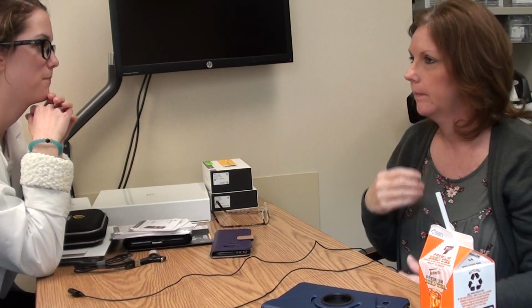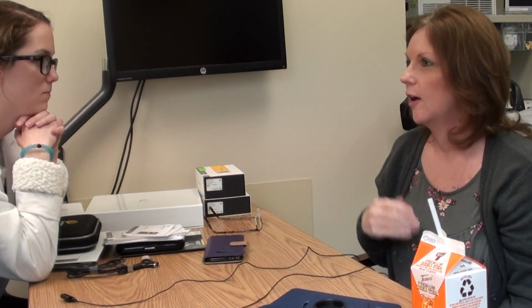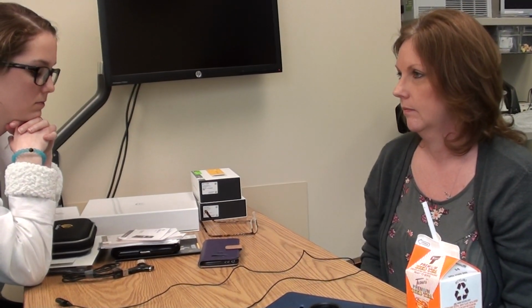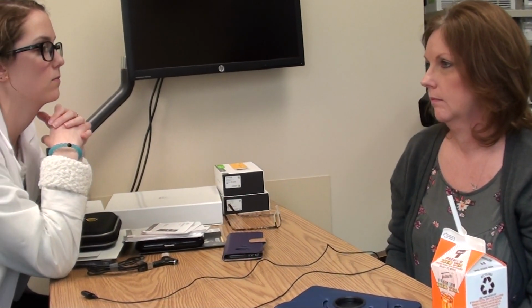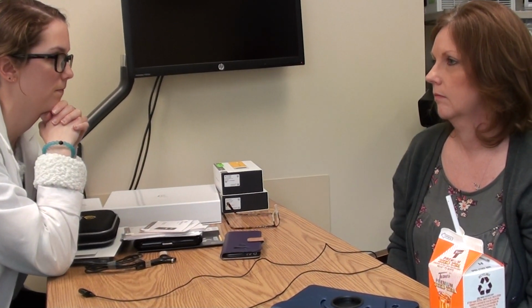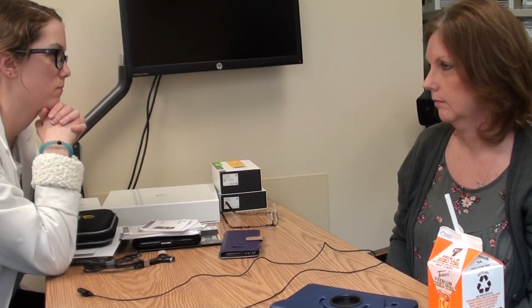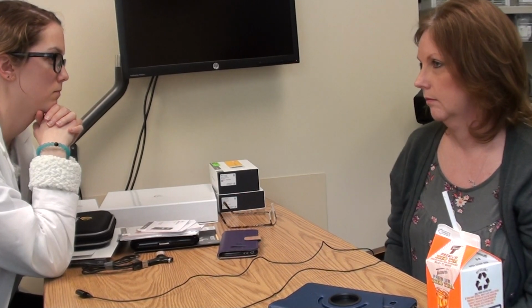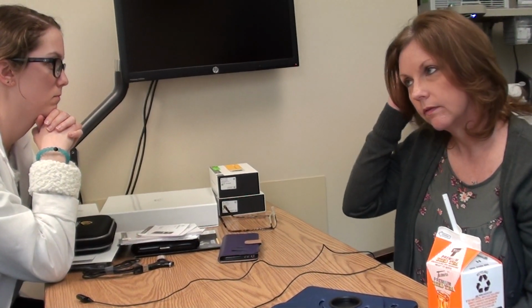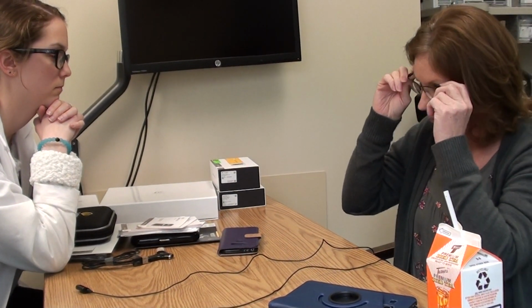Good. Do you hear it or feel it turn on as soon as you put that magnet in? Yeah, I can tell. There's your turn on. So it's a good thing for you in that you know immediately when you put it on the right spot because you'll instantly start to hear or feel that sound. And same thing goes if you knocked it off, all of a sudden that'll go away. So as soon as that coil's not in the right spot or off of the magnet, you won't hear anymore. But if it's on there, it won't fall off. Nope, it'll stay on there. Okay. And you can put your glasses on too.